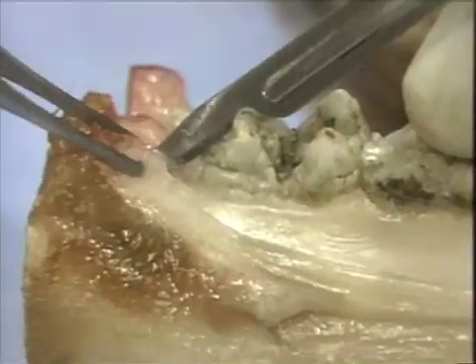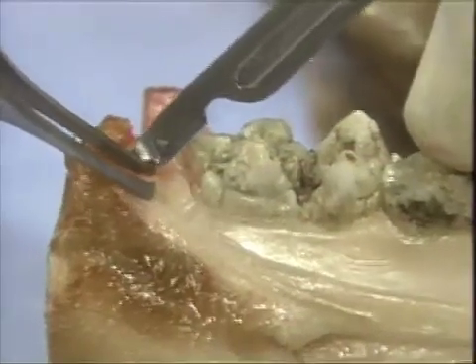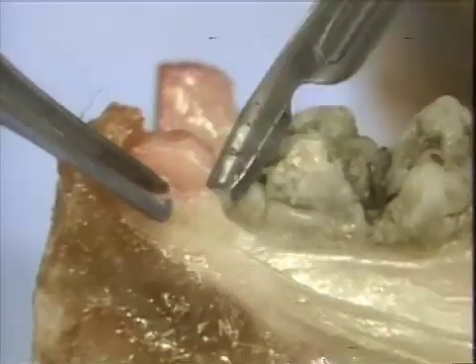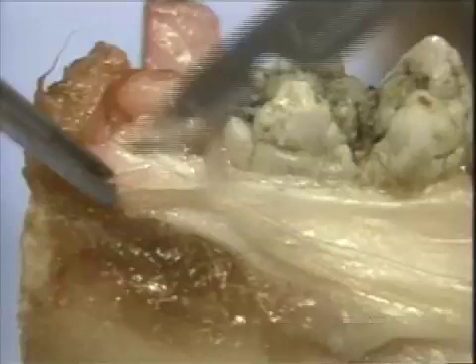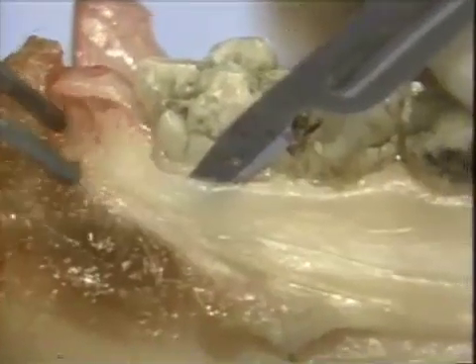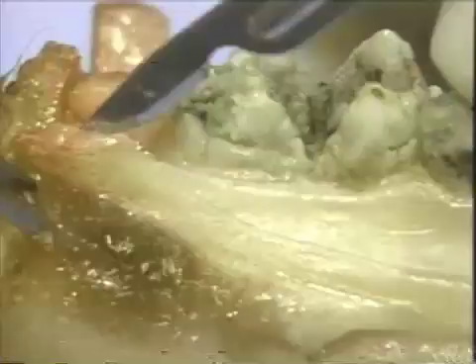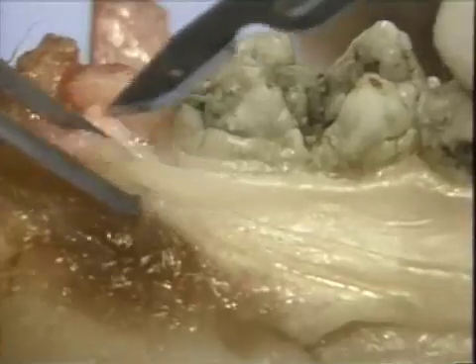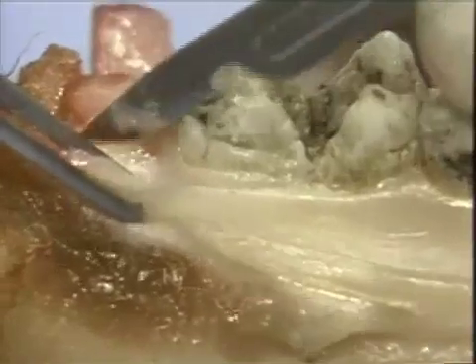The buccal papilla is gently elevated and undermined or thinned. This undermining incision is carried throughout the tissue down to and continuous with the alveolar crest. It is important that the tissue be adequately released at the distal line angle of the terminal molar tooth in order that the buccal and lingual flap be reflected for access and visibility.